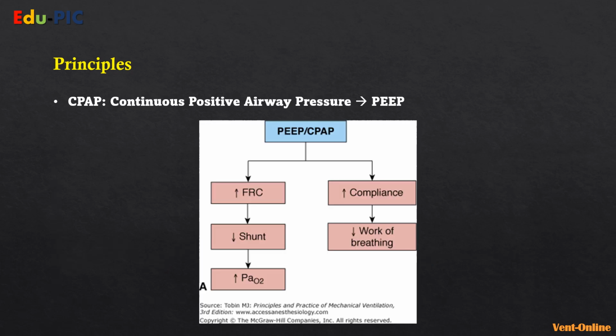Okay, so in that case, what am I expecting to achieve with PEEP? What's the benefit? Why am I using PEEP or CPAP? What's going to happen? Well, as you improve the lung condition and get less areas being under the alveolar collapse element, then by opening up more of the lung space, then you're achieving more functional residual capacity. Also, you're decreasing the areas that are seeing less oxygen, which means you're decreasing the internal shunt. If you remember from our first lecture, we talked about it.